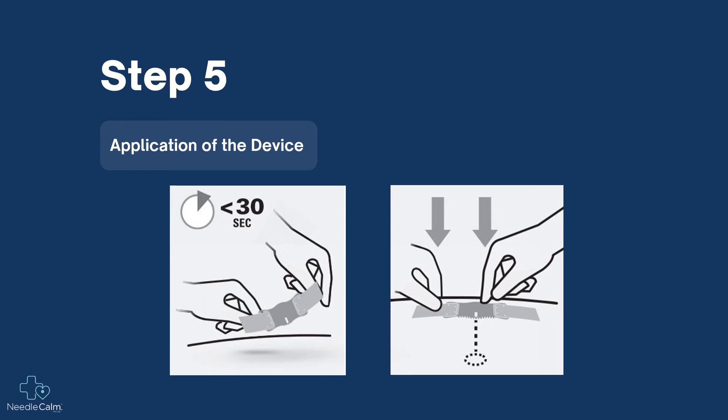Apply the device to the chosen site with the adhesive and spikes contacting the patient's skin. Press firmly on the device whilst peeling off the protective backing from either side, ensuring adequate skin adhesion and gentle pressure.